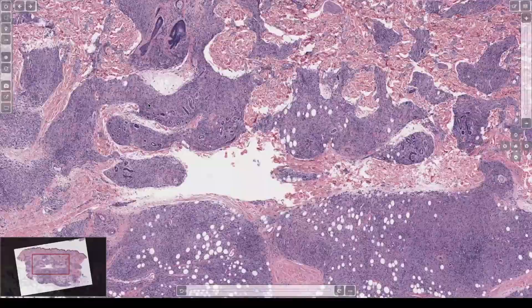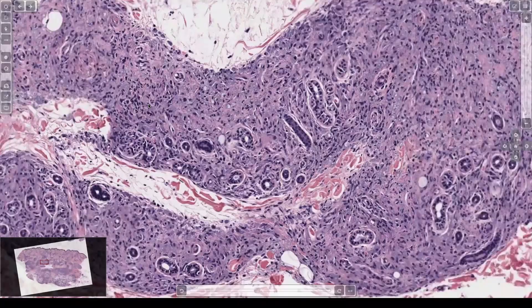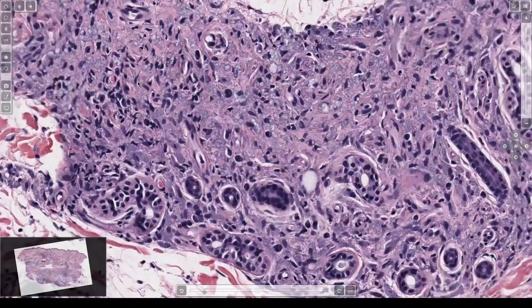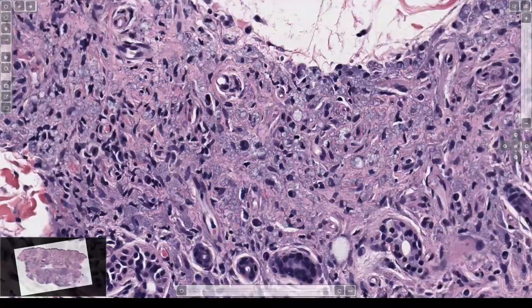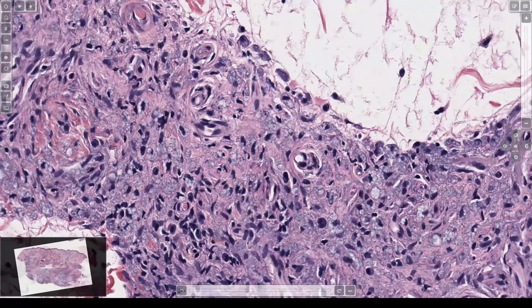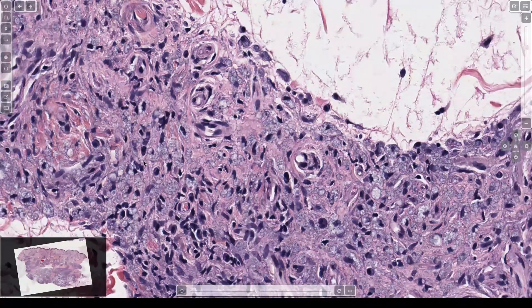Let's go closer and see what this infiltrate is. It's cells with a bunch of cytoplasm — that should make you think of histiocytes. Whenever I see cells and I'm not sure what kind they are, my answer is histiocyte.